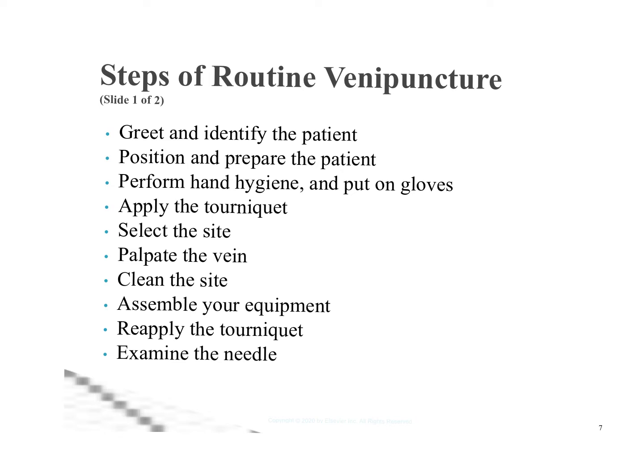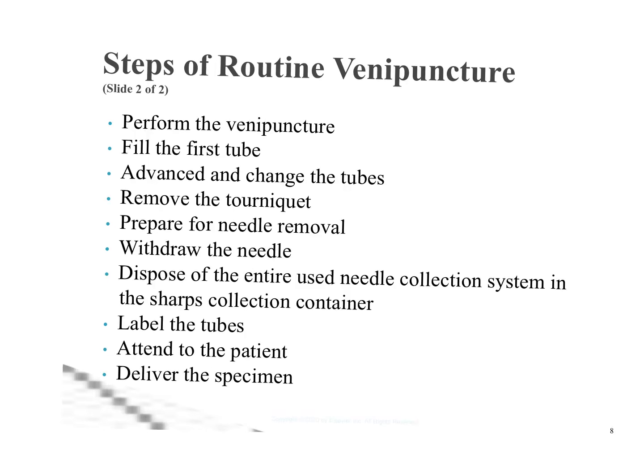I always like to clean the site after I put the tourniquet back on, because if you clean it prior to that and something touches it and you don't notice, or something does and you have to clean again. Then we would perform the venipuncture, fill the first tube, and advance and change the tubes, remove the tourniquet, prepare for that needle removal, withdraw the needle.